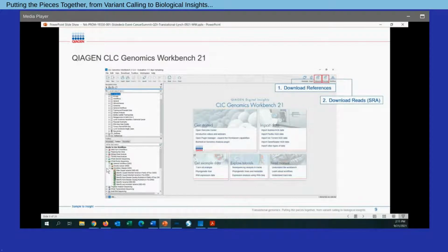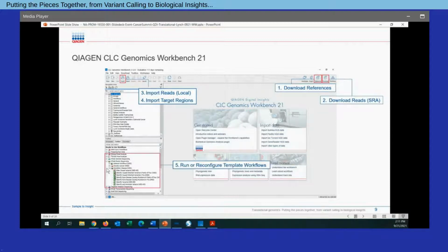Downloading our sequencing data itself. Again, we're going to pull data from this study on Lynch syndrome, so we're going to pull it from the Sequence Read Archive. If we were to import our own samples, we would do that step as well, and then also bring in targeted information for our panel of interest. And then very lastly, running a workflow to call our variants and get our endpoint to transition into interpretation.